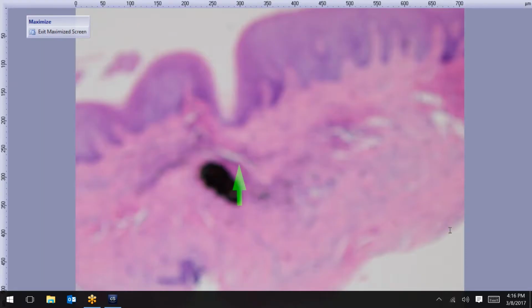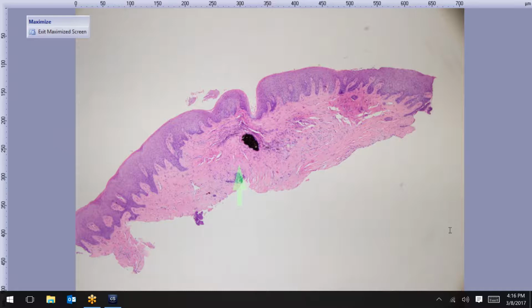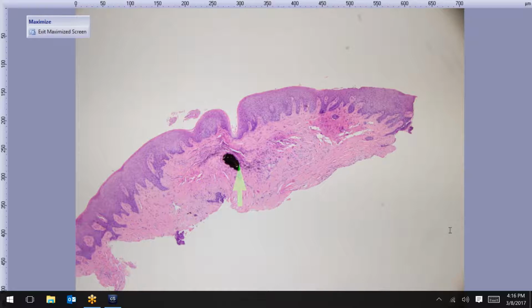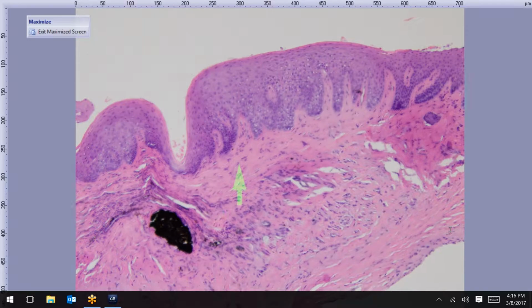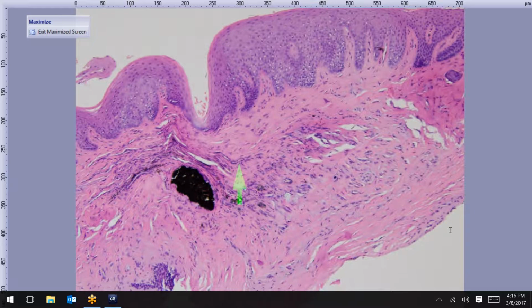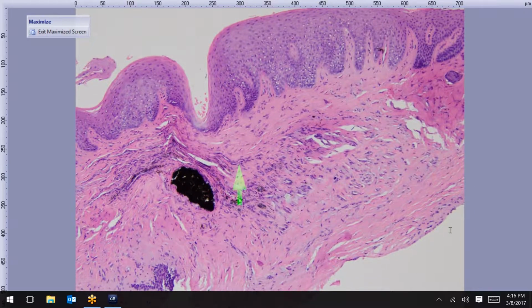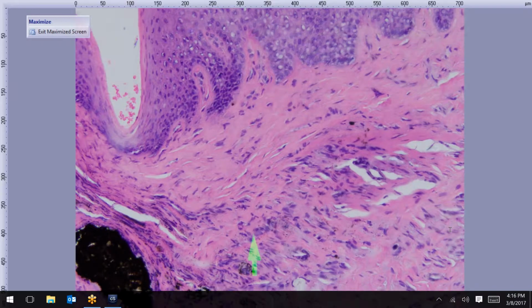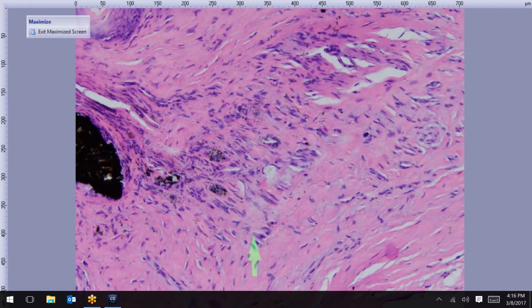All right, we have a pigmented lesion inside someone's mouth. And you see this big obvious clump of foreign material right here. I would say you don't always get such a nice obvious clump of foreign material in this condition, but usually you get what we see here when I go on higher power, just these little dark foreign particles. Someone has listed amalgam tattoo, and that's exactly what this is. So it's a great case of an amalgam tattoo.